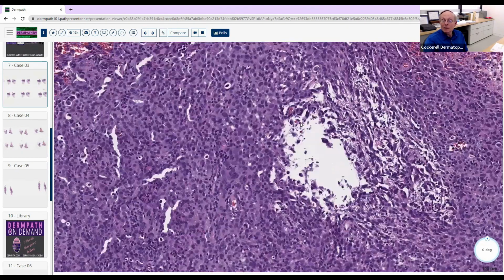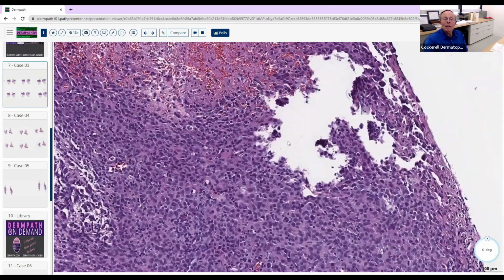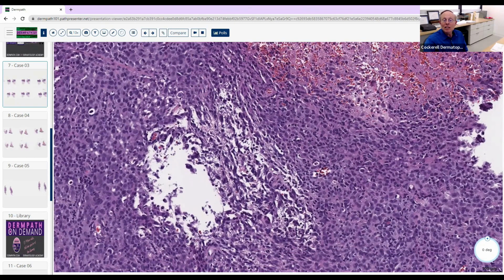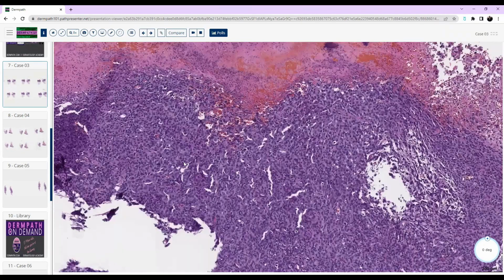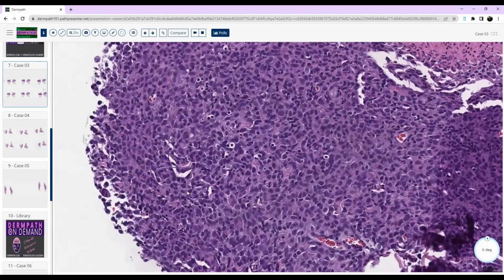This is kind of a challenging case in a way, because it does look a lot like, in some ways, histiocytes, like epithelioid cells, but it's got these little small spaces here, these kind of cleft-like areas here. Can you appreciate those? Does that give you any kind of clue when you see slit-like, cleft-like spaces in something that may be a cancer? Yes. There are lots of extravasated red blood cells, and I saw some of those cells that look like they have the punched out appearance from the vacuolar degeneration. So you can think about angiosarcoma.